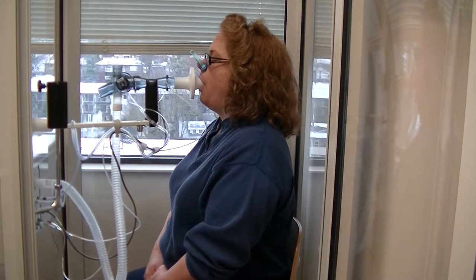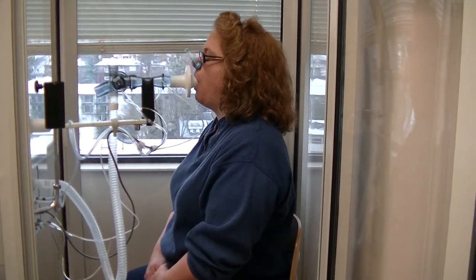The next one will be a little deeper like a sigh. Empty your lungs. Blow it out. Keep blowing, keep blowing, keep blowing, keep blowing. Now really deep breath in — in, in, in, in, in.